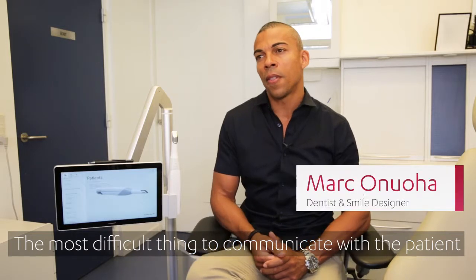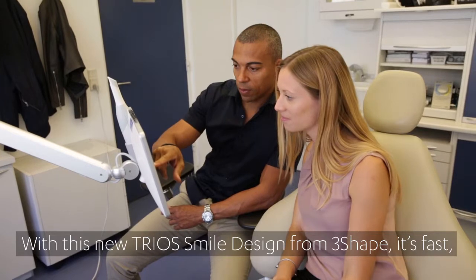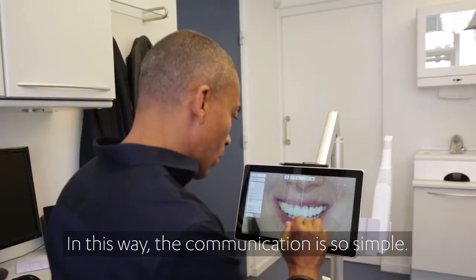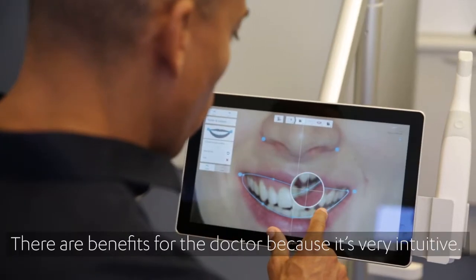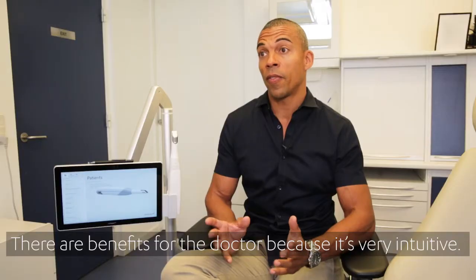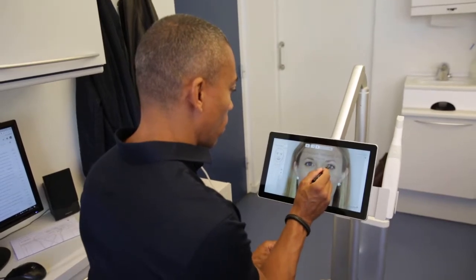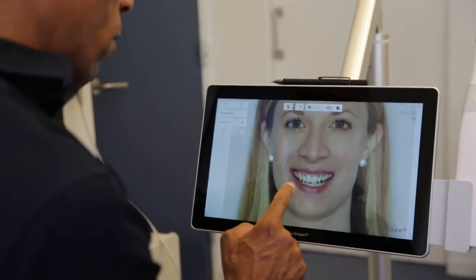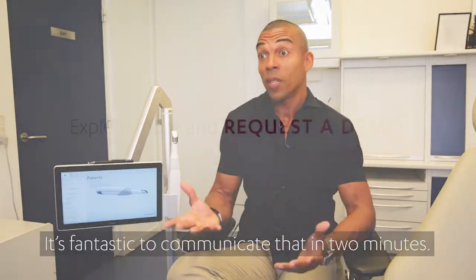The most difficult thing to communicate with the patient is the end result. With this new smile design from Trias, it's fast. It also looks very natural. In this way, the communication is so simple. It's so easy to be an architect. There's benefit for the doctor because it's very intuitive. It is fantastic to communicate that in 2 minutes.